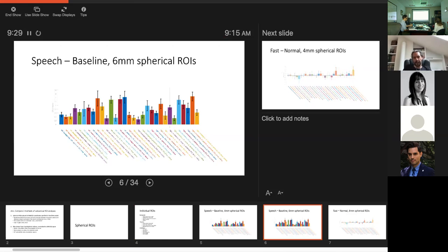The larger the ROI, the less difference the smoothing is going to make in general, and the smaller the ROI, the more difference it's going to make. So I don't have a very good answer for this. A 6 millimeter radius ROI with 8 millimeter smoothing, I think that's kind of big, but you know it. So maybe 4, or 4 and 8, something like that.